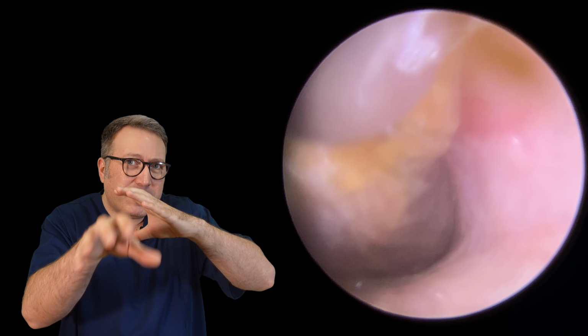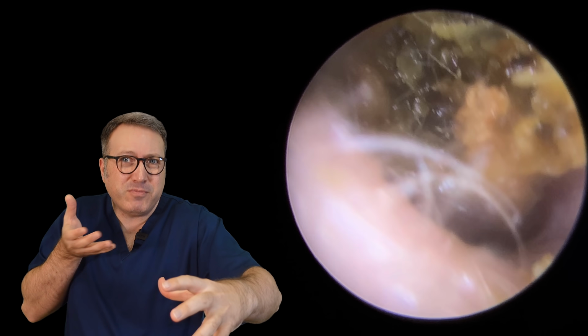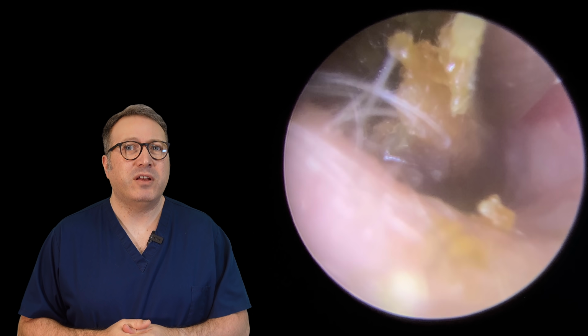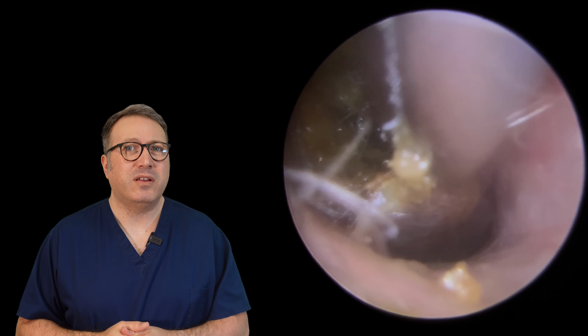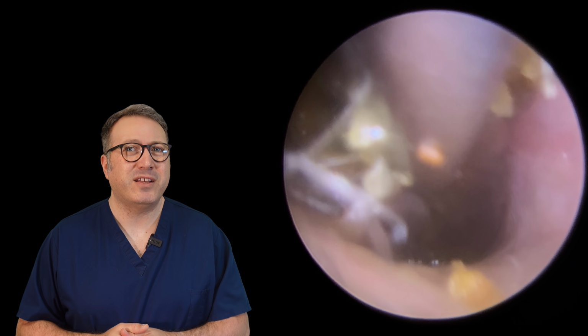You can see that bottom right corner. I'm trying to draw this around, so I'm hoping it'll detach that bottom layer of skin and the whole thing will shift. So we're just holding on now to the outside edge and lifting there. Pulled it forward slightly. Let's see if we can get a grip.